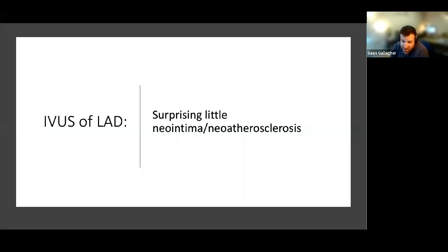Okay, but I think that's an important point, though, Andrew. I think the more IVUS we do, the more we're starting to understand about vessel sizing. That classical teaching of angioplasty, certainly when I was training, I was taught that proximal LADs were 3.5 millimeters in men and 3 in women. And that's what we should be aiming for, and maybe a 3.5 millimeter stent in the right coronary artery.